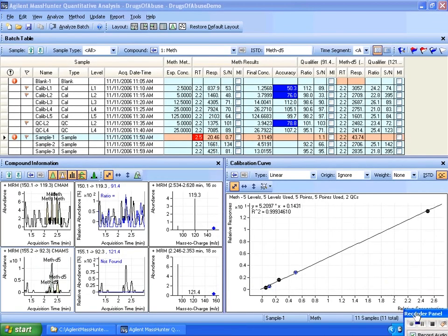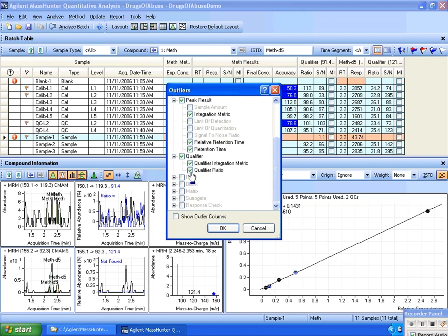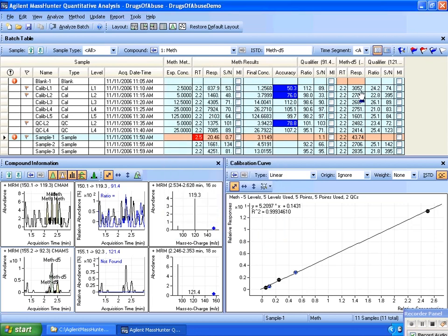Let me introduce you to the outlier toolbar, which is sitting up here. First, I'll be able to see the outliers that are turned on by default that I showed you in the introduction here. I'll also show you the capability of filtering. You can see I have the drugs of abuse batch here, and I've got several different kinds of outliers. The accuracies are showing up low because they haven't adjusted the calibration curve. We just talked about the retention time of the methamphetamine being high.